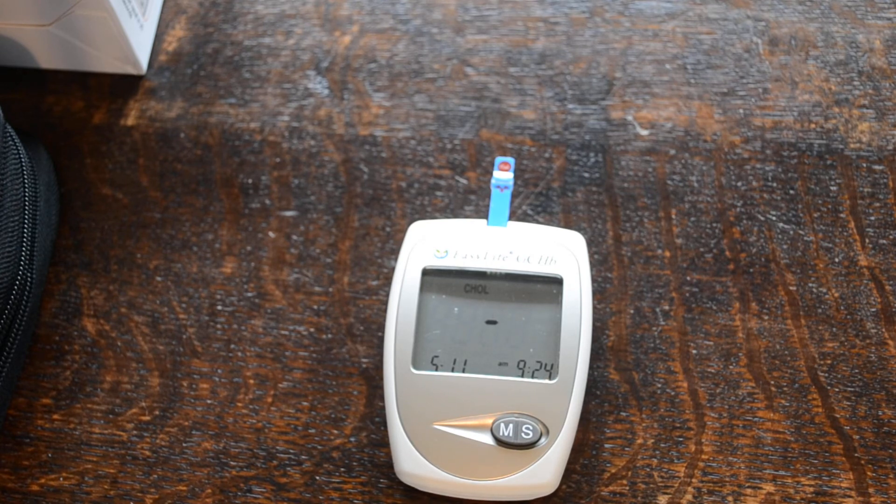Cholesterol needs 15 microlitres of blood, whereas to do a glucose test strip you're only looking at three or four. So it varies between three or four seconds and 15 seconds to give you a reading. So that's everything you need to do home testing for cholesterol, uric acid, and glucose, all in one meter.